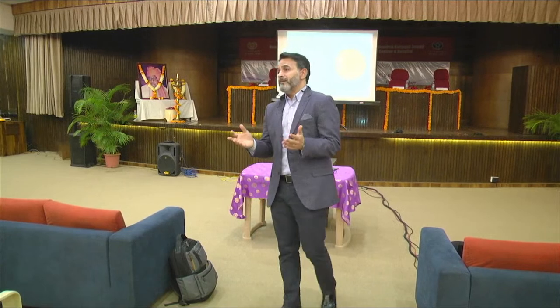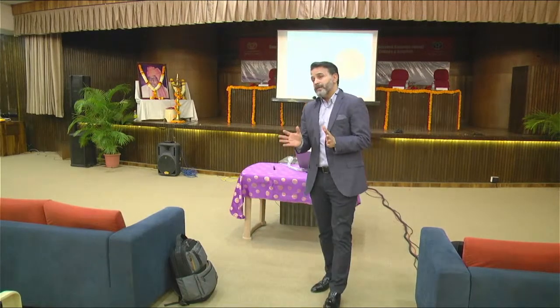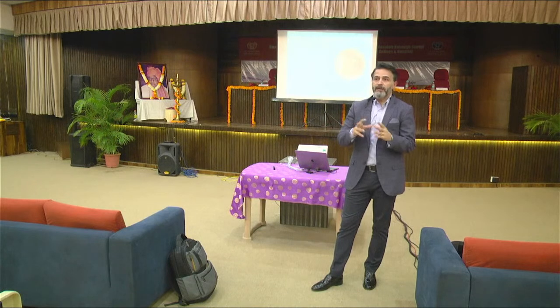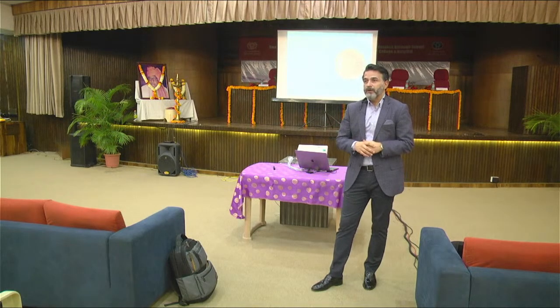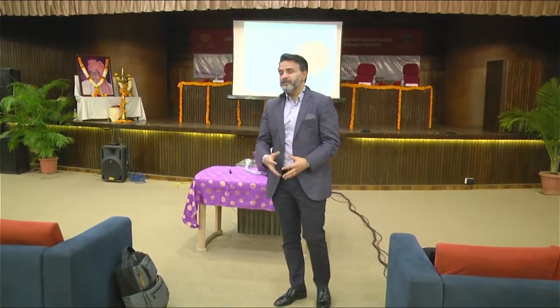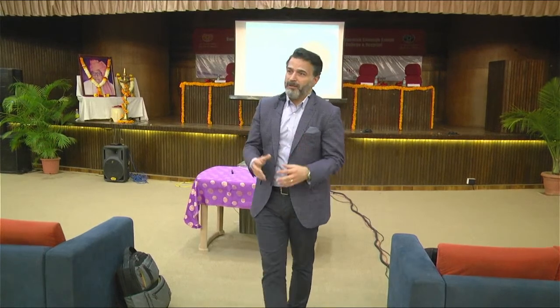So I can say nothing about this. Zygomatic implants are something different, okay? And if you're in that situation, you should follow the advanced surgical skills and procedures, but not with M-Guide. I'm sorry, it cannot do everything.